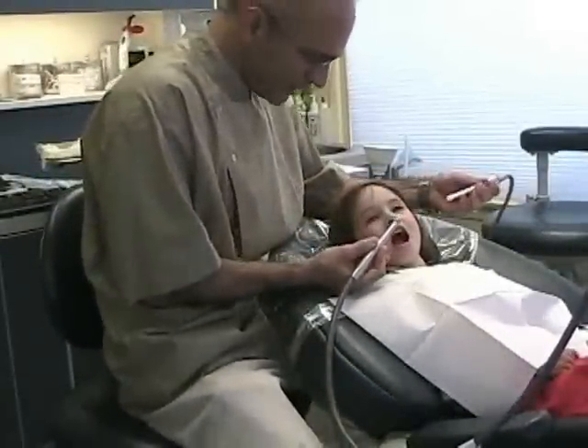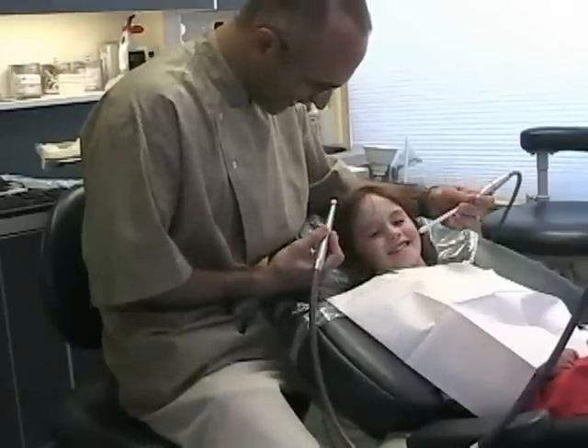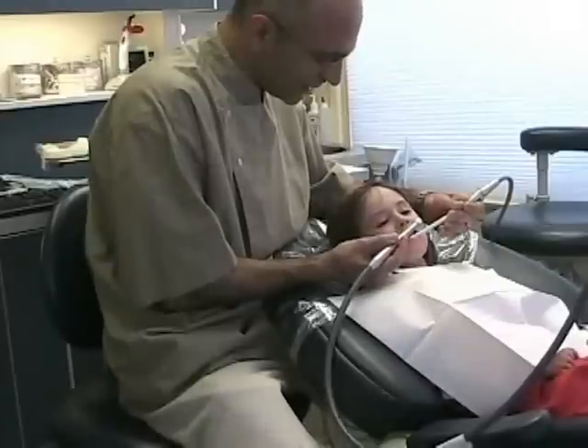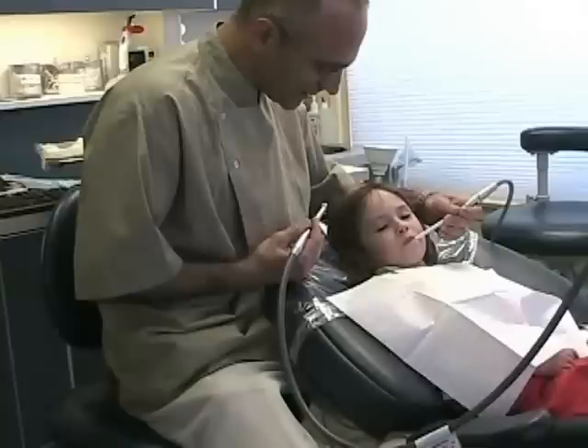I'm just going to hold this here and we're just going to pump it up. Then you can close your lips around it. Alright, let's do it one more. A little water first — don't be afraid. And close your lips around it again. Good job.